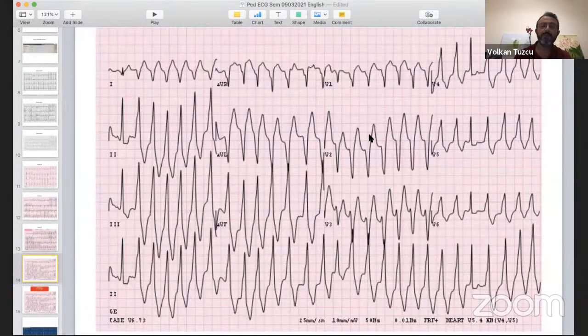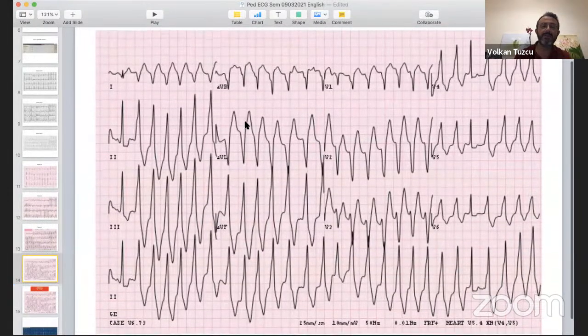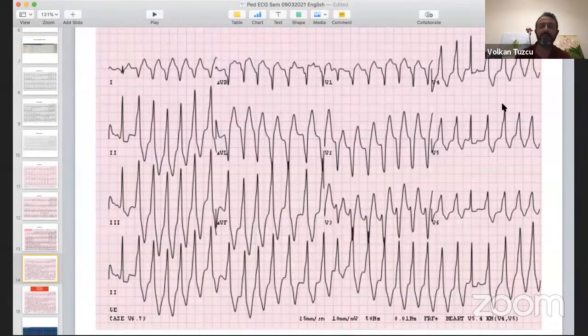So we go to another patient. A stress test induces this type of tachycardia. So what is the difference in this one? Again, stress test induced. This is the rhythm we see. It looks like wide QRS, right? Is it uniform? Almost uniform, right? But what is different? Not quite exactly the same morphology. You see there are some narrow QRSs. So you should be suspicious of VT whenever you see this, right?